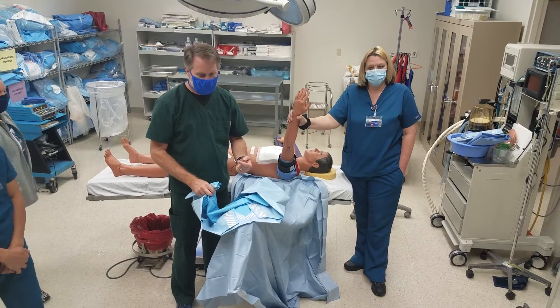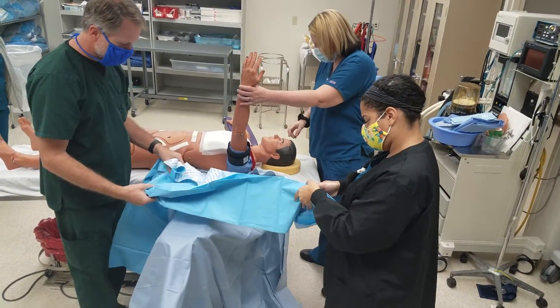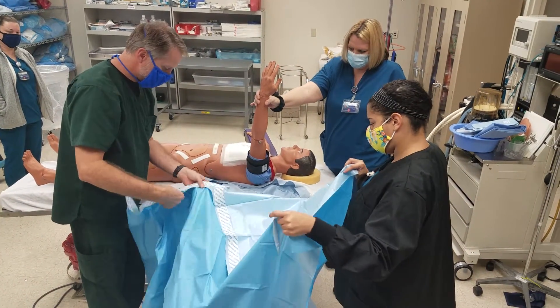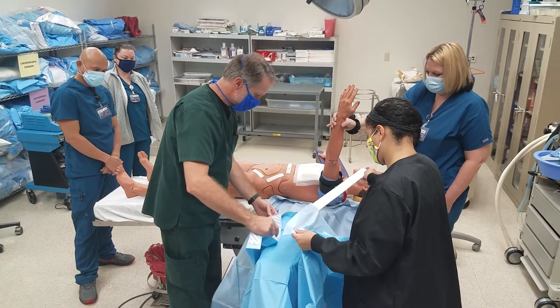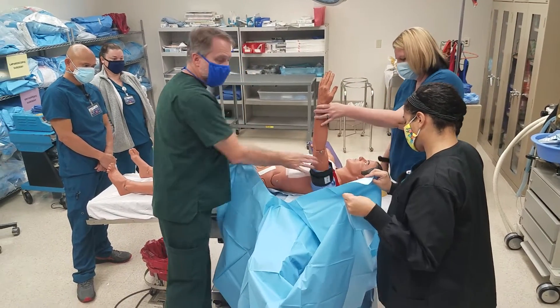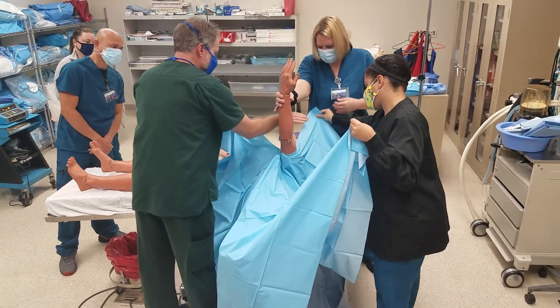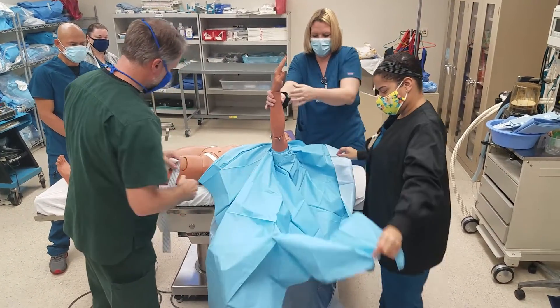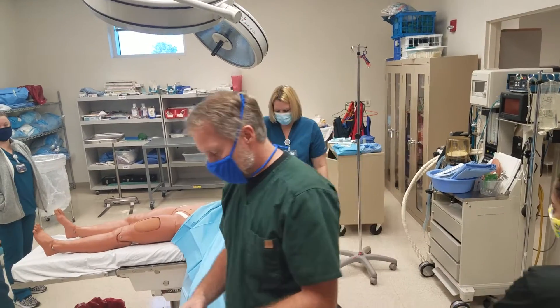So who's my partner here? Why don't you hold that — I'm going to pull it towards you. Take that and open it down that way. Now let's deal with the stickies. You're going to see people get messy with that stuff — it'll make a lot of trash. I'm going to pull it like this. We want to exclude all this — we're trying to cover that up. So we're going to place this thing just so we cover that up. Now you've got a piece to it — since you're starting to peel, bring it around to me. And I'm going to bring this one around to you. So that's one — go ahead and let that drop. We're going to put a second one on, opposite the first. Some places will only use one of these.